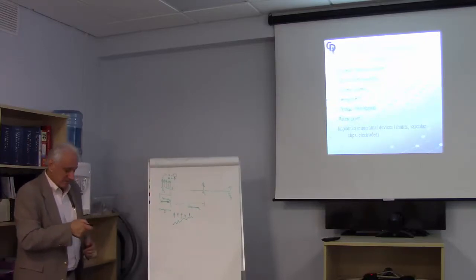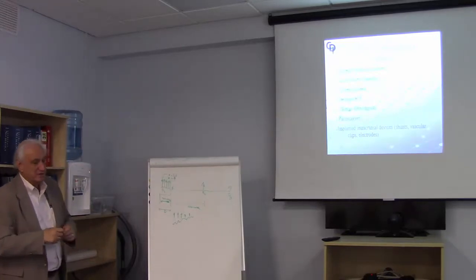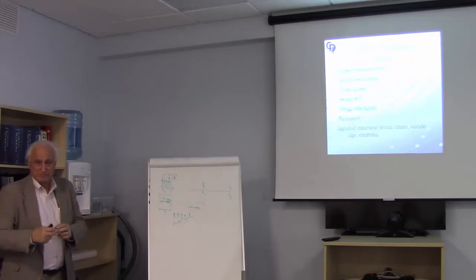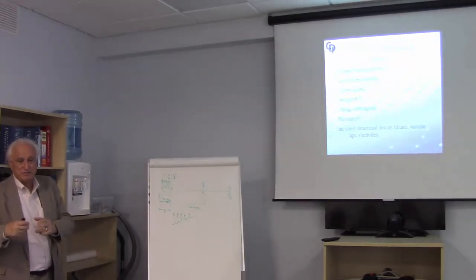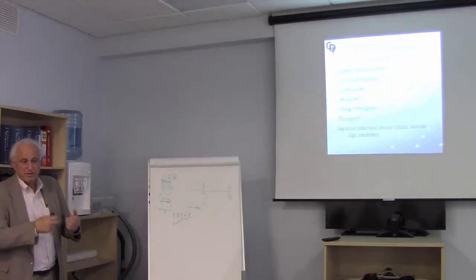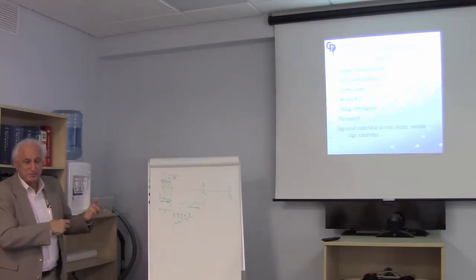So to me, these are the most important contraindications, to make sure that you've discussed with the surgeon that this is something you've got to consider. Is the relative value of doing the transcranial stimulation appropriate given the fact the person's got a clip or an aneurysm or something?